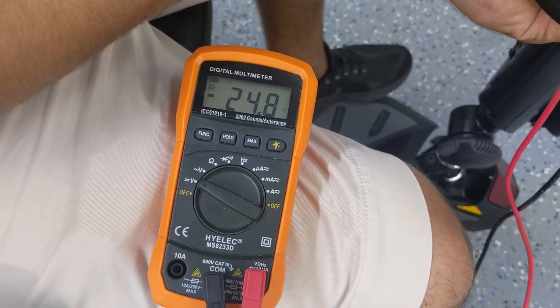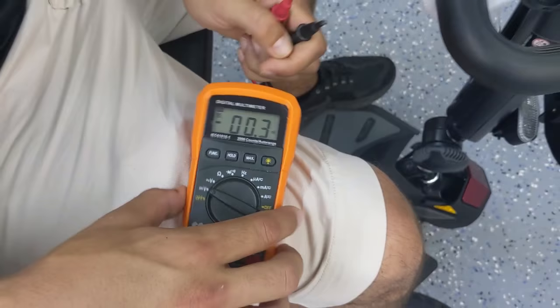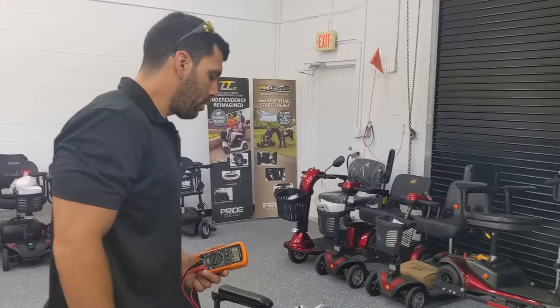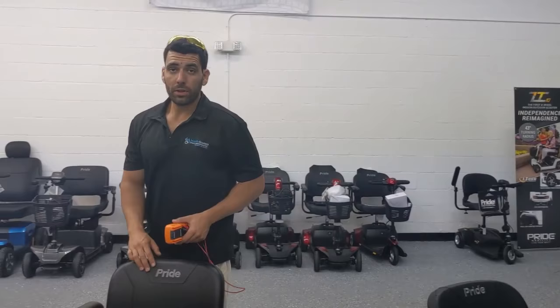If I were to perform this test on a unit that has batteries that are no good, this voltage while moving would drop down below 22 or 23 volts. That's a sign that your batteries are not performing well under load and they're going to need to be replaced. Sooner or later you're going to run into that situation where the battery only lasts maybe an hour or 30 minutes, until a few weeks later they're just completely done.